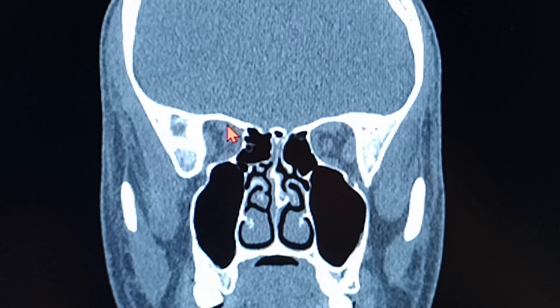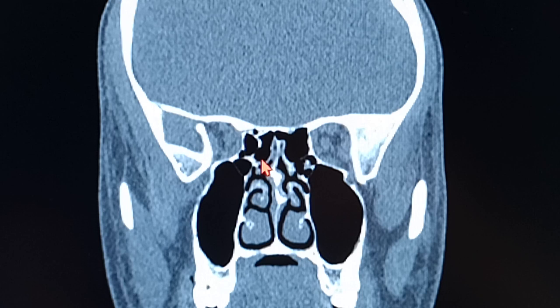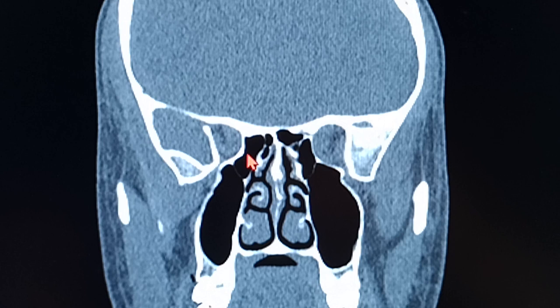That's the inferior orbital fissure. If I keep going behind, you can still see the frontal bone over here. And see, this is completely horizontal. This is not oblique. This is posterior ethmoidal skull base. So if you see oblique and the anterior ethmoidal artery, it is anterior ethmoidal skull base. If you see it is horizontal and behind the anterior ethmoidal artery, trust me, it is always posterior ethmoidal skull base.